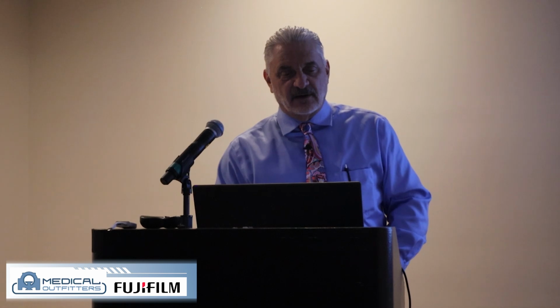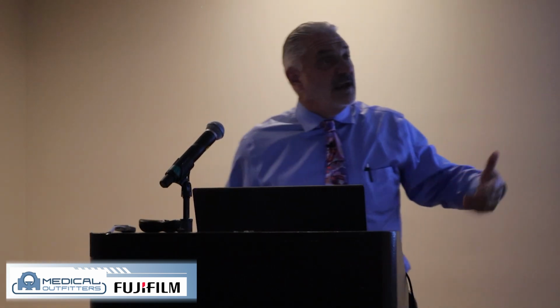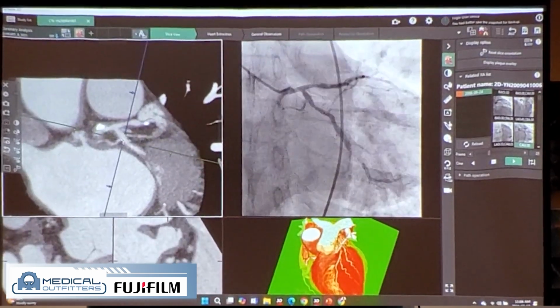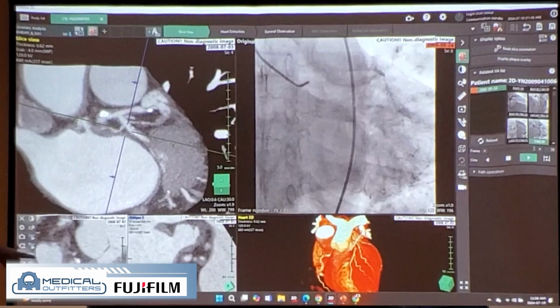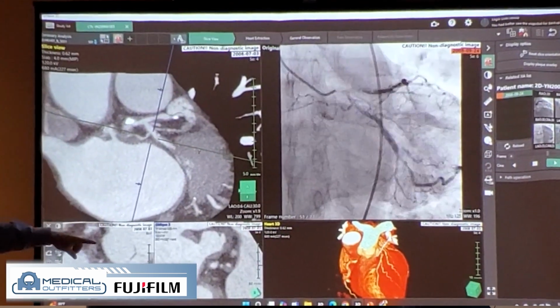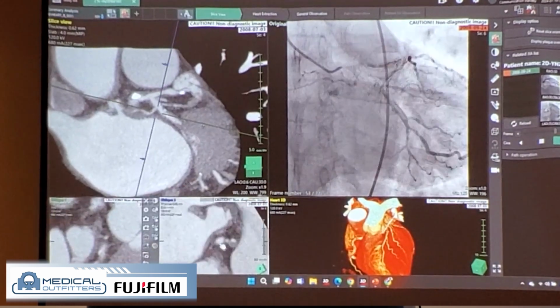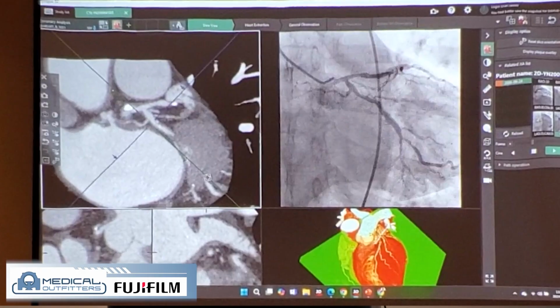If I click on another cath view here, it brings me up to a great look at the bifurcation and the circumflex, right? The same thing: I would come over here, get in the middle, and pull this over here. You can see that this is going to be a parallel view, which is thicker, and then we have a perpendicular view, which is the cross-sectional view of that particular artery. I could scroll up and down that, and if I grab onto the planes, that's nice.